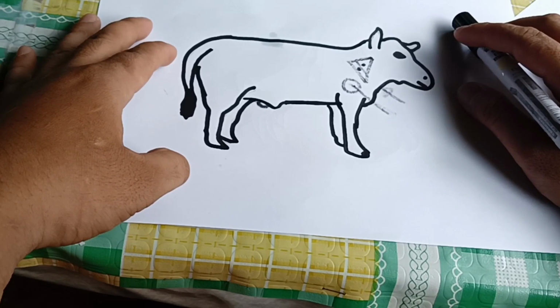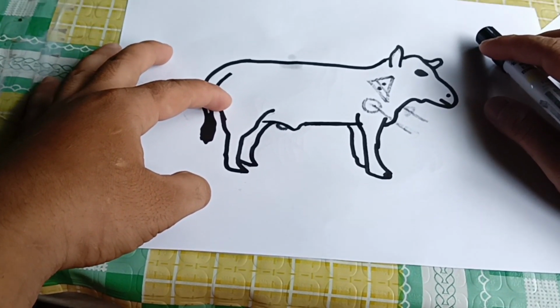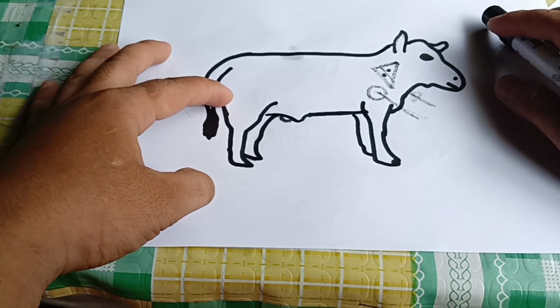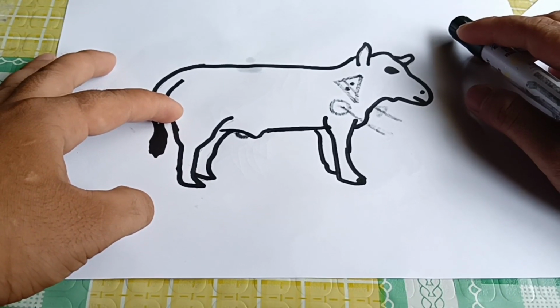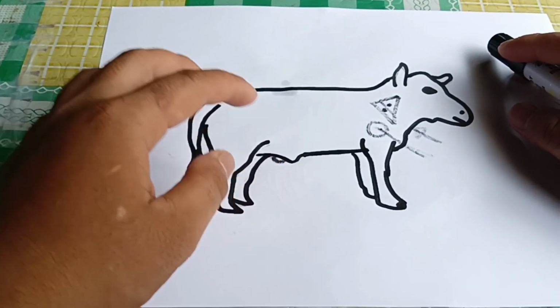Lastly, for the intramammary injection, the site also is at the teats of the cattle, just like the goat and the swine. With the absence of a needle, insert the cannula equipment for the administration of the medicine. So this is the teat of the cattle. And those are the sites of injection of those different kinds of animals. And now, let's proceed to the angles of injection.